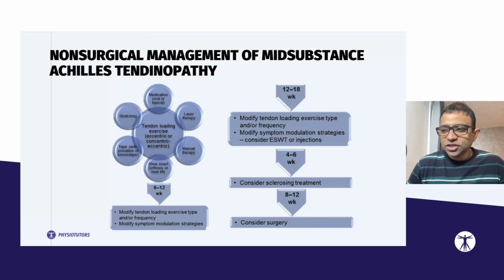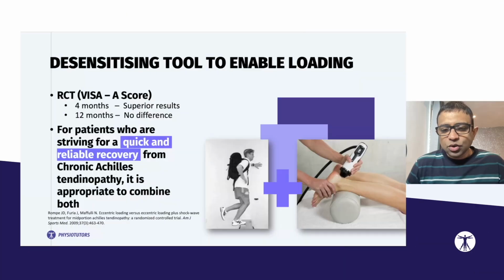After 12 to 18 weeks, you've done the rehab, the patient is still in a lot of pain, then you have two options. In 1 year, it might not be massively different, but if you're struggling with pain here and now, then having Shockwave is a fantastic desensitization tool, which is quite useful to help us reduce the pain.